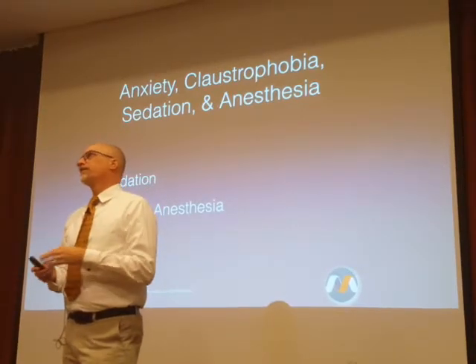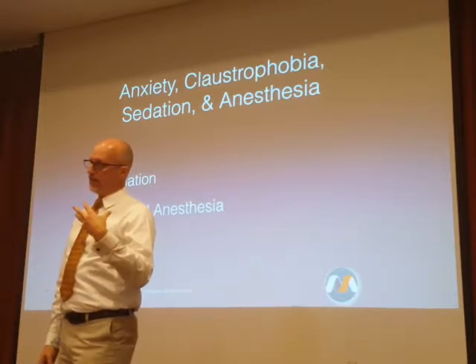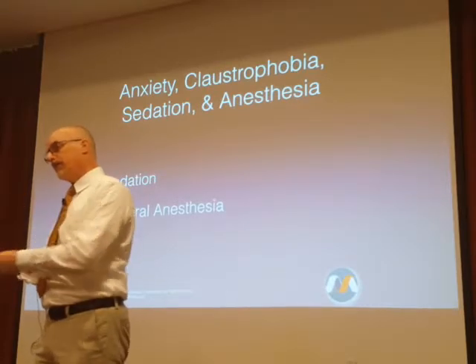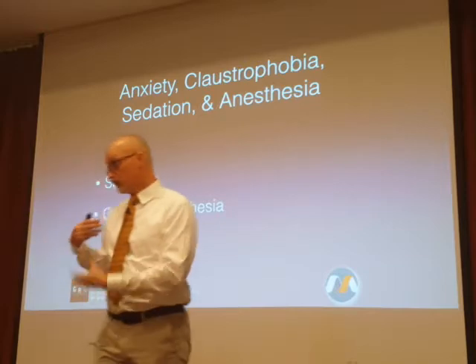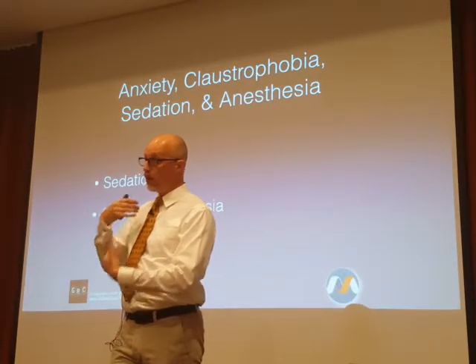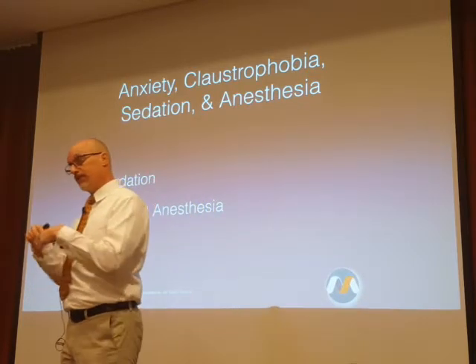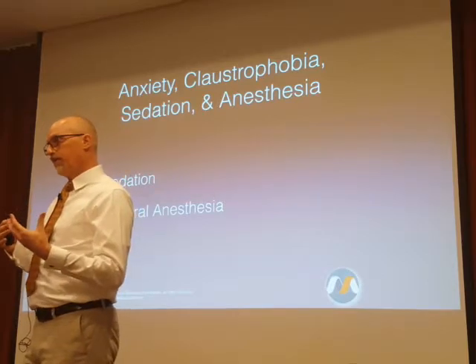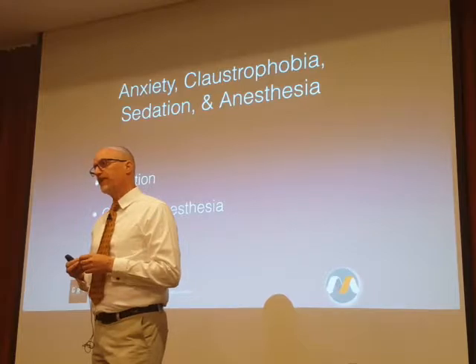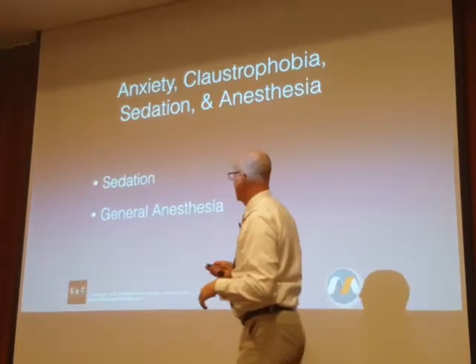So I would be careful about presumptions that if it's inside the body, it's more likely to heat up as opposed to outside the body, because it's really going to depend dramatically on where within the body and what the thermal characteristics of the tissues around it are. Within the exam, the heating will depend significantly on the exam.